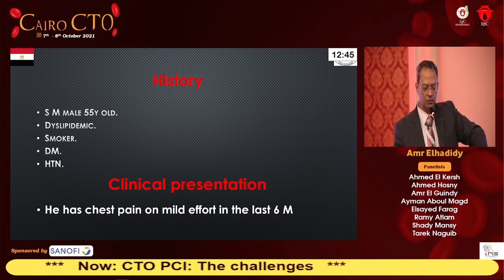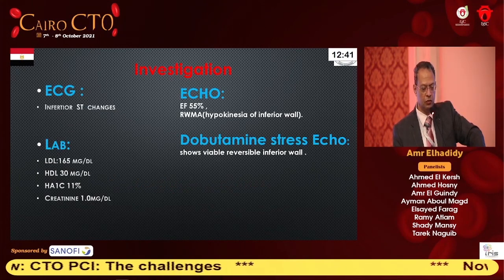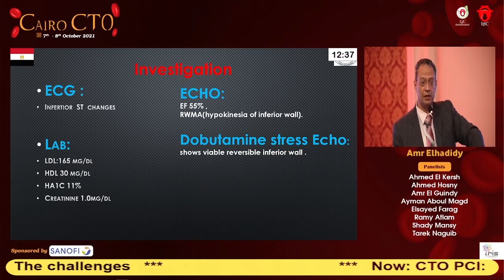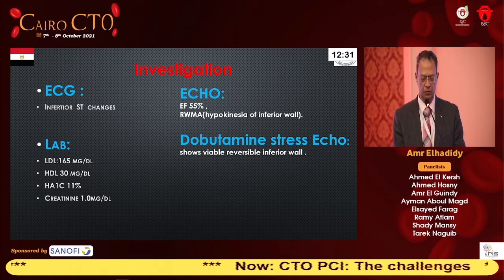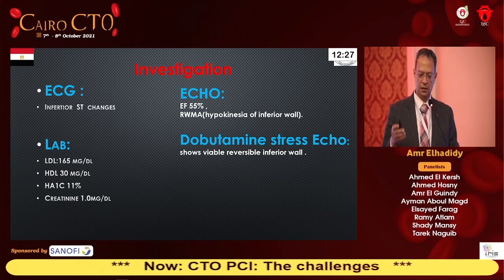A 55 year old man with mild effort angina in the last 6 months. So we need to do dobutamine stress echo to see the viability. This is a very important message. And definitely this patient had a viable reversible inferior wall.